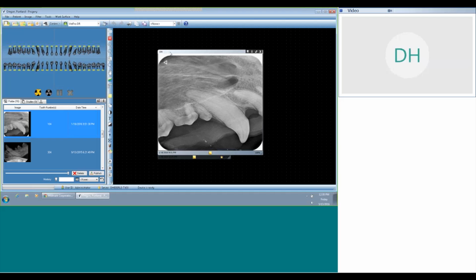One little clinical tip that I have for you is when you're acquiring the canine teeth on the maxilla, and this goes for canine or feline, I really like to just focus on that canine tooth by itself. We'll definitely get in other teeth depending on the size of the patient. Here we have that outer incisor, and we've got our first, second premolar in here. But all of those teeth, other than the canine tooth, are a little distorted. Sometimes they won't be distorted, but chances are they're going to be a little distorted. And because you're using digital, whether CR or DR, it doesn't take long to get those other teeth separately.